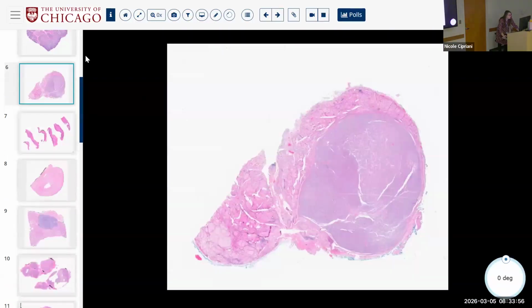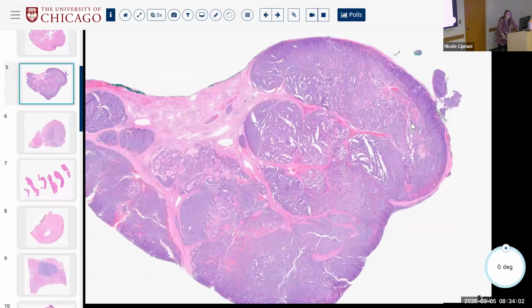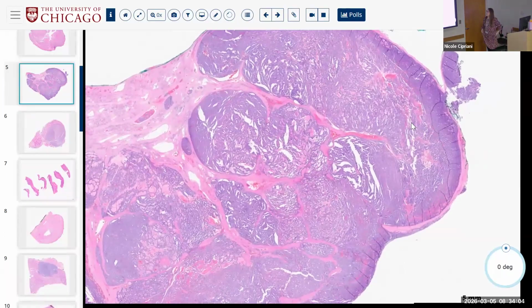So is this classified as a high grade follicular derived thyroid tumor then? Whatever the name in the WHO is for the high grade. Yeah, so the high grade global category is high grade follicular cell derived, so not medullary, right? Non-anaplastic thyroid carcinoma. So follicular, non-medullary, non-anaplastic.